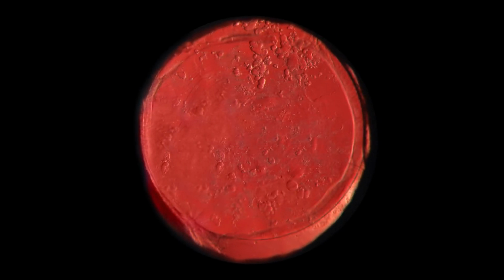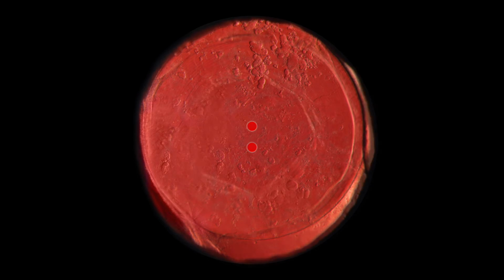Now I will show you the effect from the surgeon's point of view. Here you can see the aiming beams in focus directly on the capsule. They are overlapping, forming one circle. Now pushing the focus about 1.5 mm further posterior behind the lens into the vitreous. Two red aiming beams are now clearly visible on the posterior capsule. An energy level of 2 mJ should be enough to create an initial opening, and after a few shots we see this intermediate result.